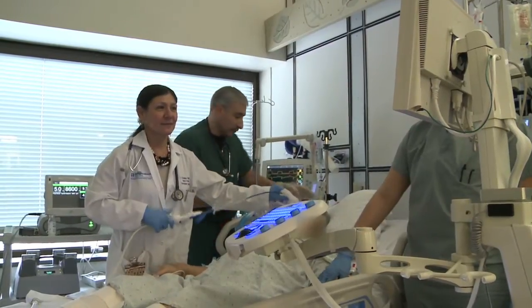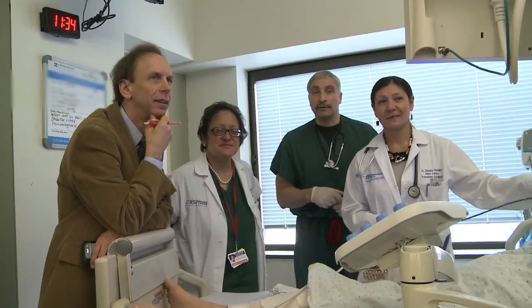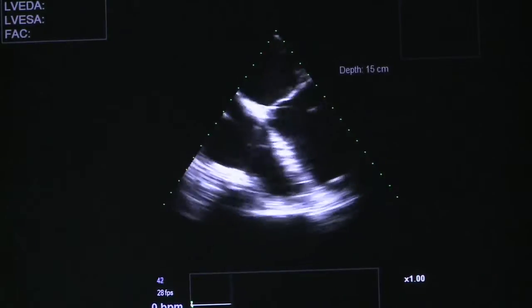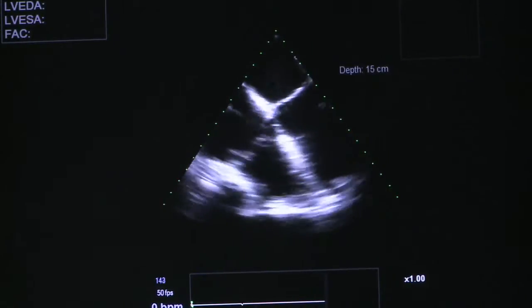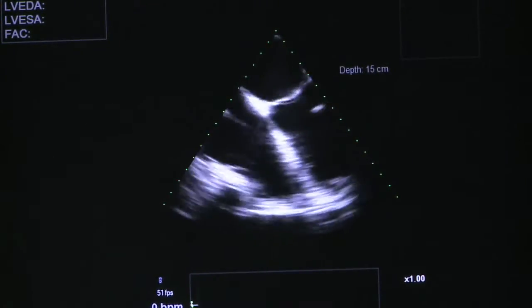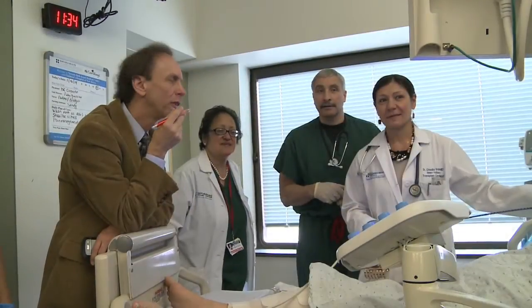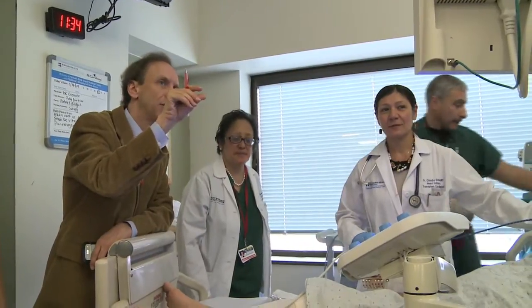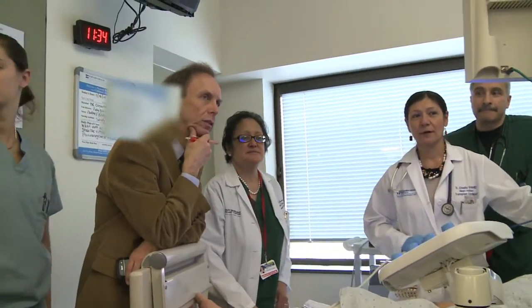The HTE probe is excellent in showing us very nice images of both right and left ventricles — really all chambers of the heart. It also enables us to see if the aortic valve is opening or closing, which helps us in terms of how we adjust the RPMs. It gives us all the vital information to guide us with respect to what the RPM should be on both right and left sides, and enables us to optimize the flows on both sides.